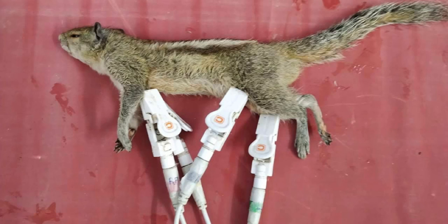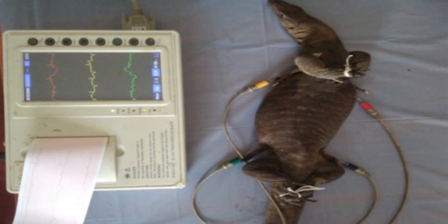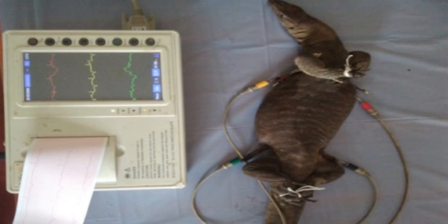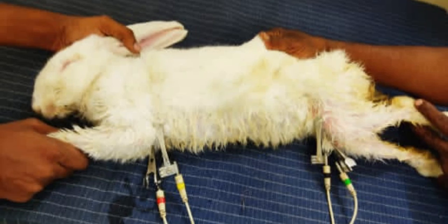ECG has also been performed in rescued squirrels, monitor lizards, and rabbits as per standard protocols.